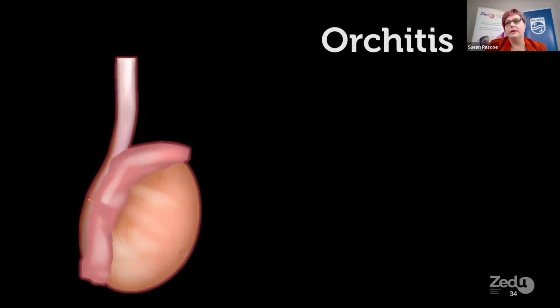So when you've got the smaller the vessel is, so fingertips, intrarenal vessels are really difficult to see. Intratesticular vessels are very small vessels. So the smaller the vessel is, the more helpful that power Doppler is going to be.